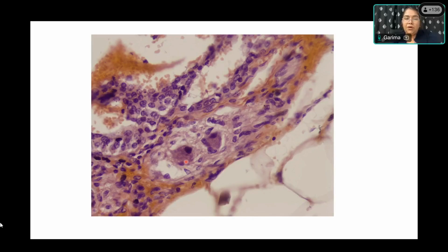So we saw a neuroendocrine tumor. Neuroendocrine, we all agree upon that. We saw some nerve-like structures, and there were huge nerve-like structures present in this case, and we saw some ganglion cells. Would you now like to revise your diagnosis? Can you think of some entity which has got all these three components?